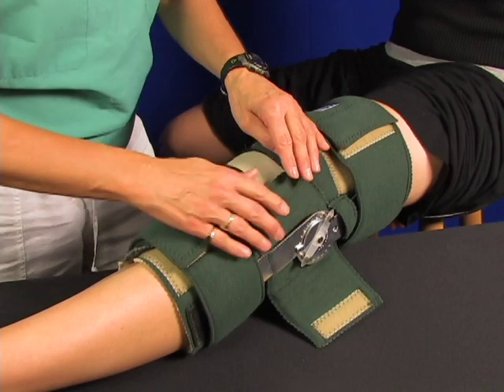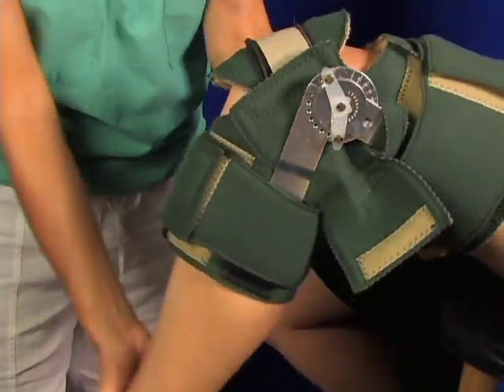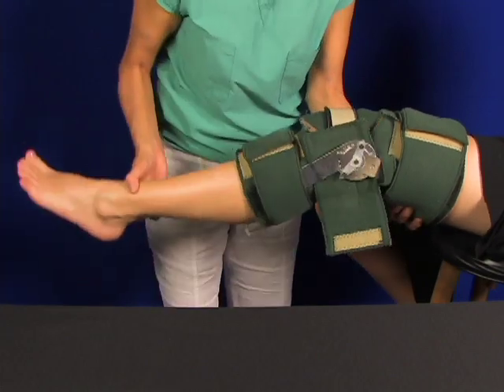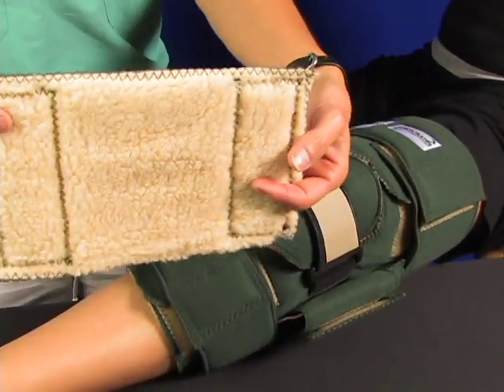Now you can see the hinge itself. See it roll through a range of motion. This one is not stopped. You've got complete flexion and extension. That can be stopped up.